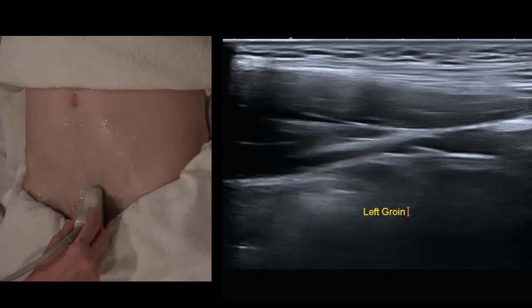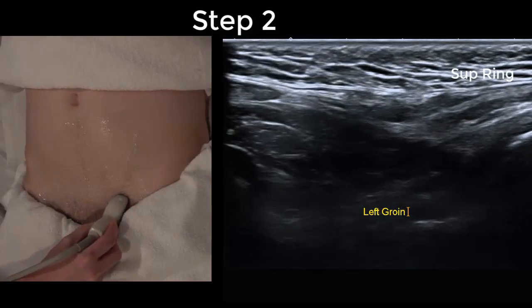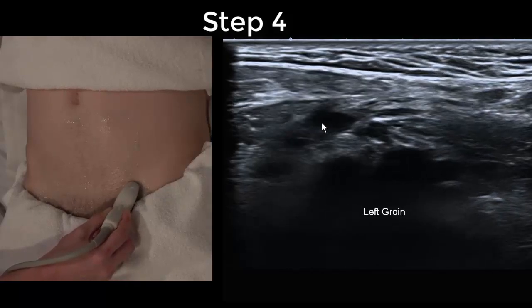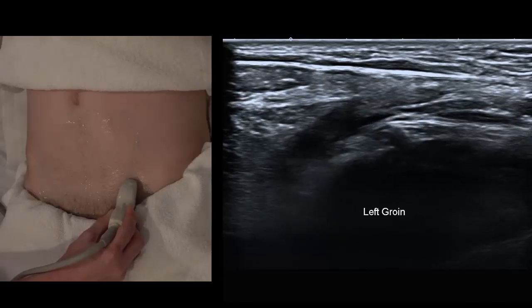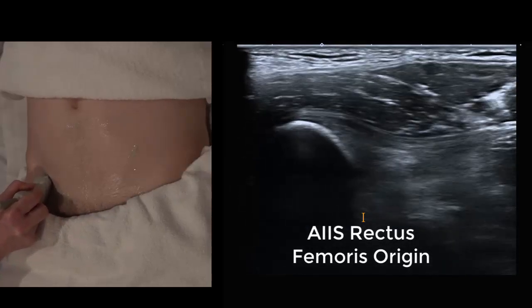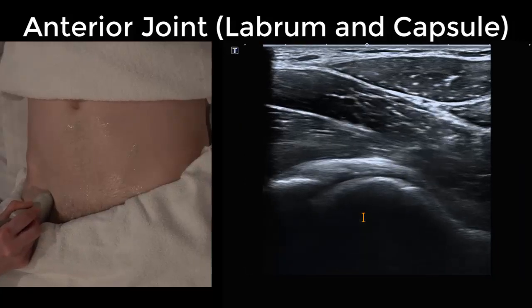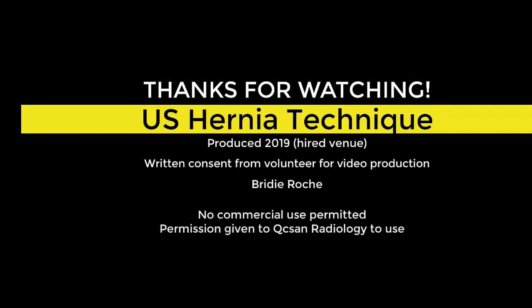Running down the rectus abdominis as you move slightly lateral, you'll see the conjoint tendon — just a thin white ligamentous structure. Step three: find the spermatic cord and follow the veins up. Step four: where they dive into the abdomen is the deep ring. At that point, ask the patient to strain — we can see the veins and our landmarks. If you don't find a hernia, you can quickly scout the anterior hip for any other causes of pain. Laterally we can find the rectus femoris origin, look at the anterior hip joint and labrum, and sometimes pick up labral cysts and hip effusions. That makes for a thorough and complete assessment for athletic pubalgia or groin pain.